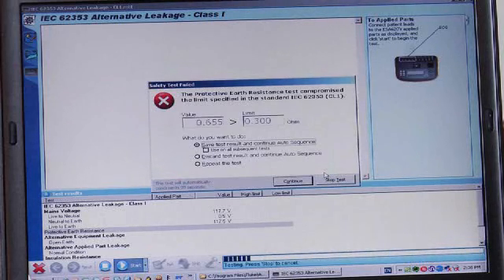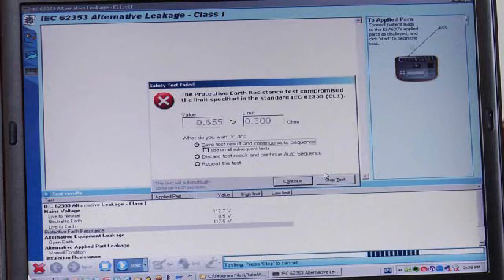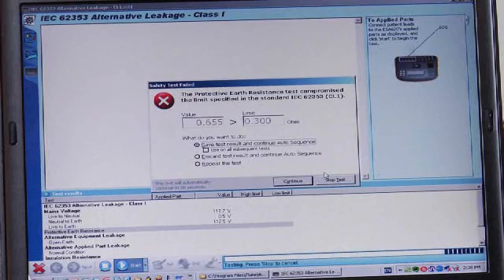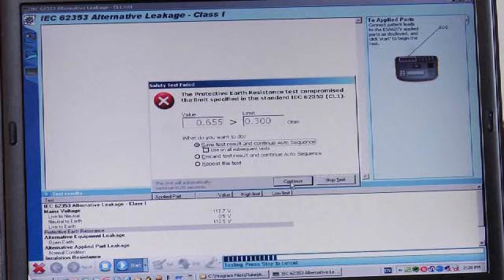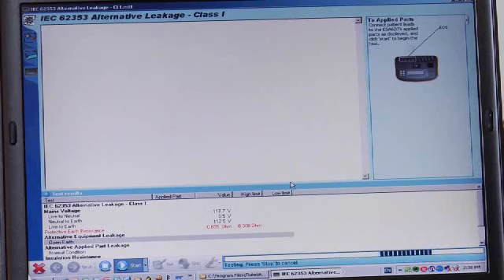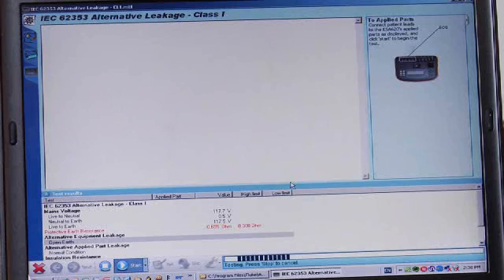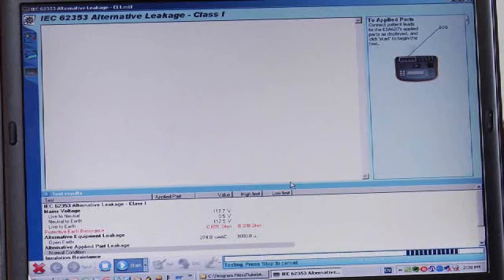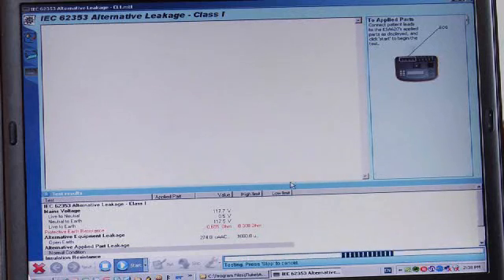It reports the resistance versus the limit in the standard and lets us make a decision to continue or not. In this case, we had a fault, which is fine. We'll go ahead and accept that for now.